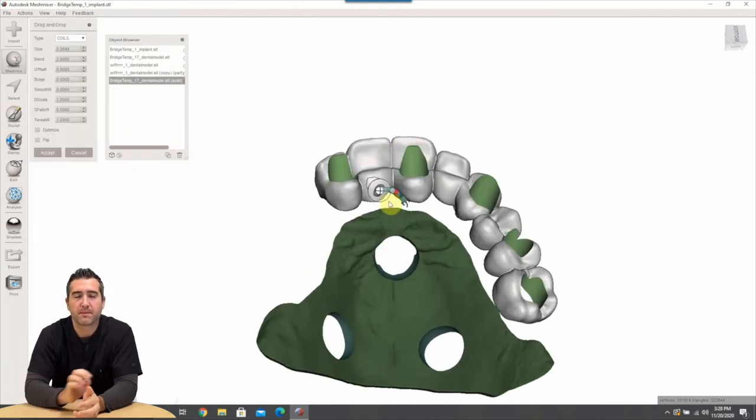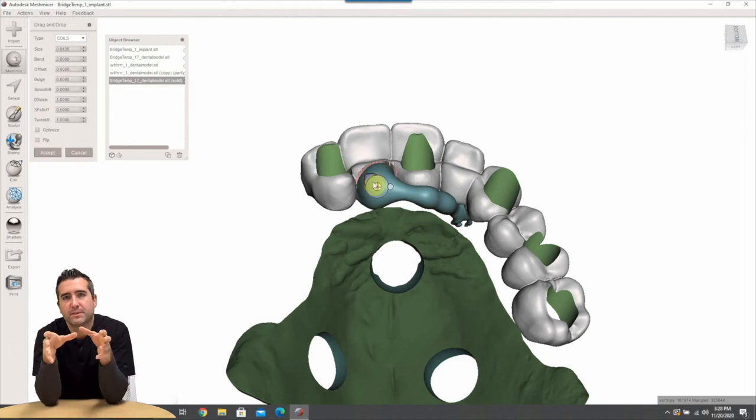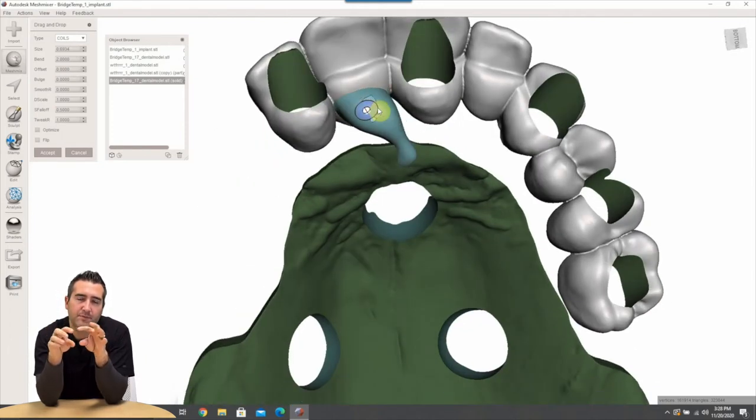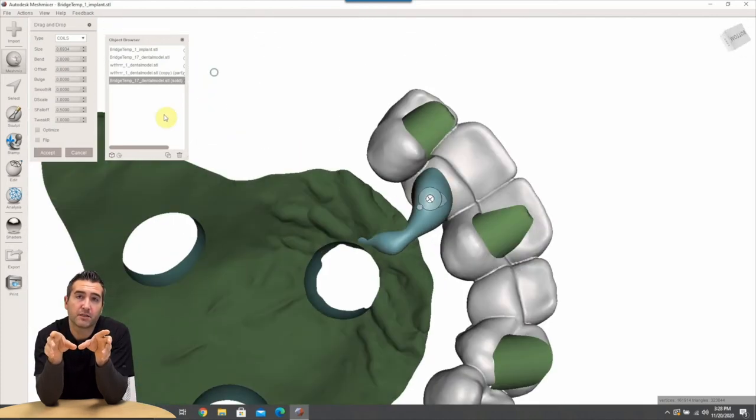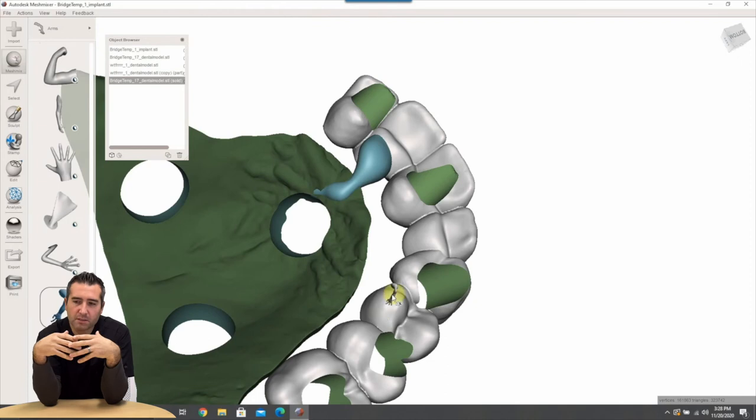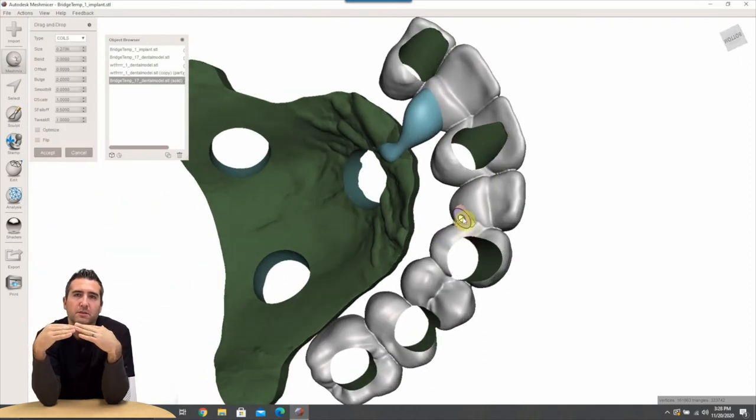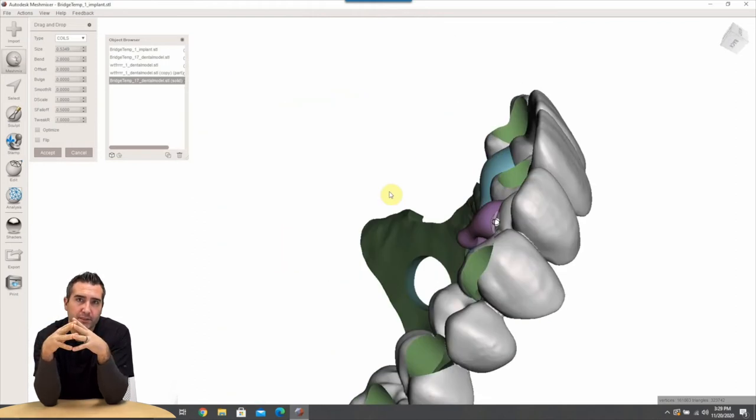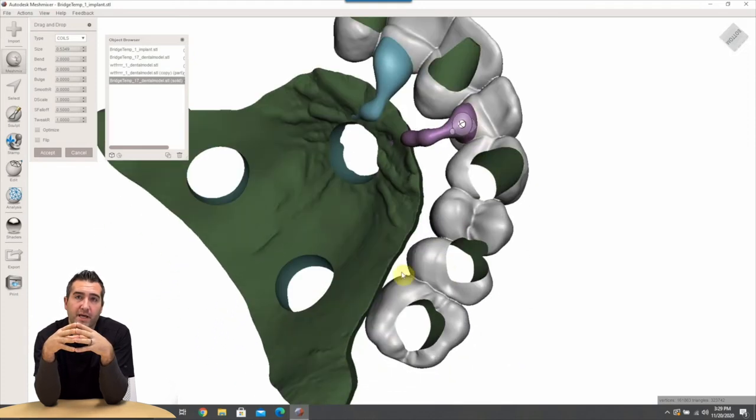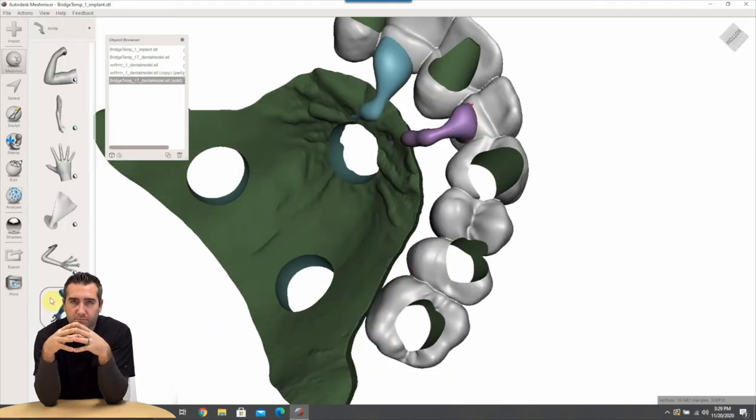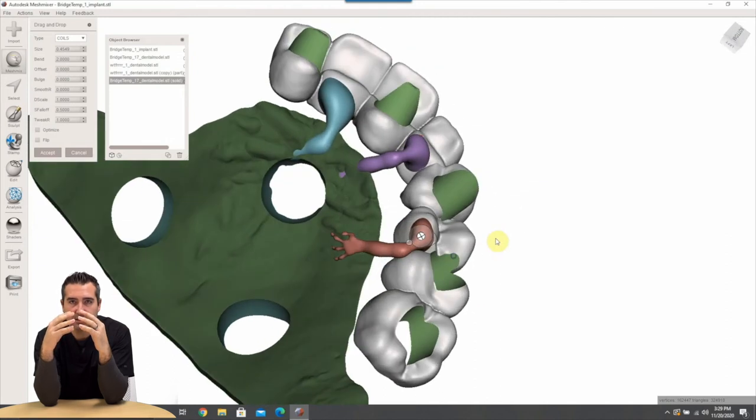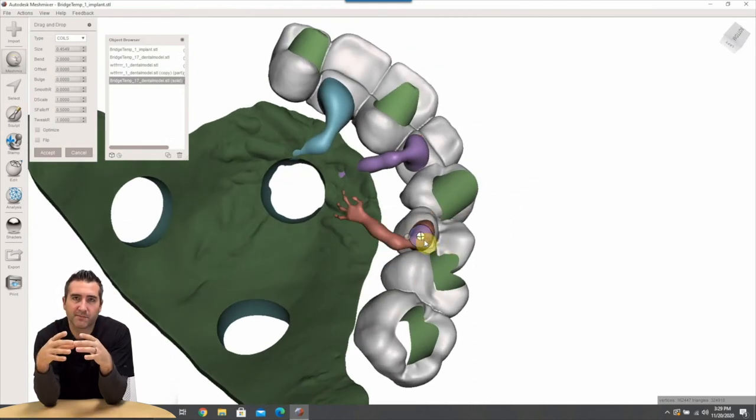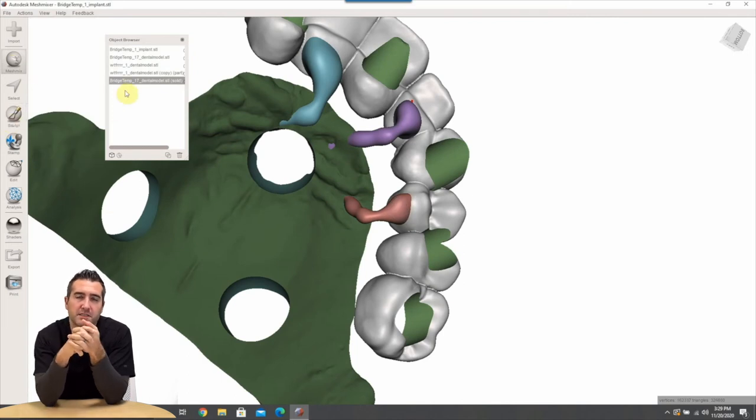So the final step, the thing that's super critical, is connecting that prosthesis to the palatal jig. Because when you pick this up in the mouth you want it to be at your perfect vertical, you want it to be where exactly you planned it. And if you don't have the palatal stop it makes it really difficult. And the mandibular we oftentimes use the retromolar pad. Yes we could have extended the tissue areas to the exact abutment margin but it's actually a little bit too precise to try to do that. This is a much better and faster way.